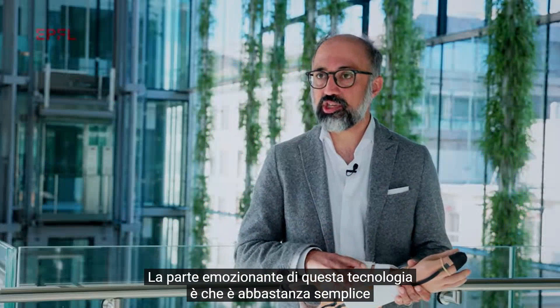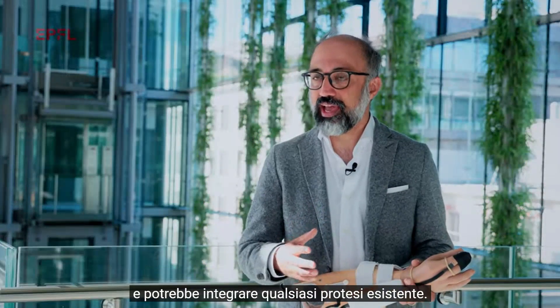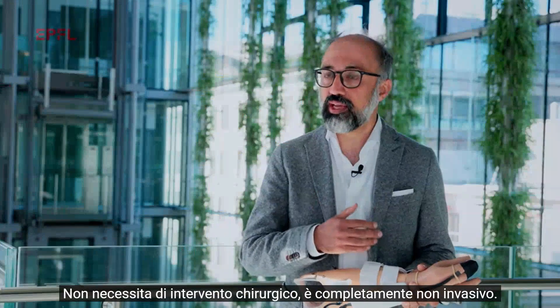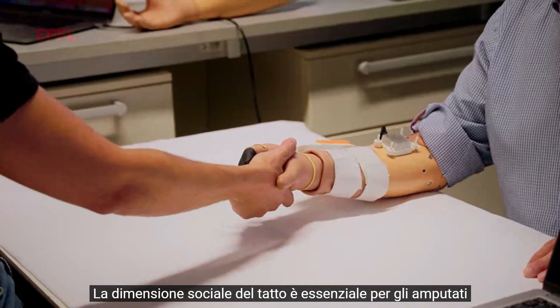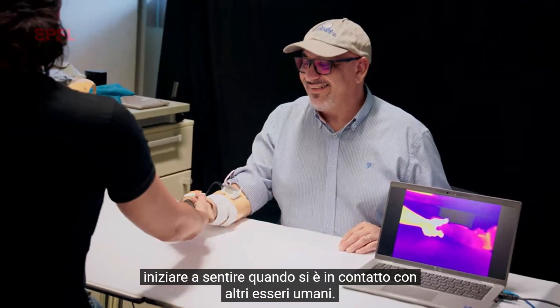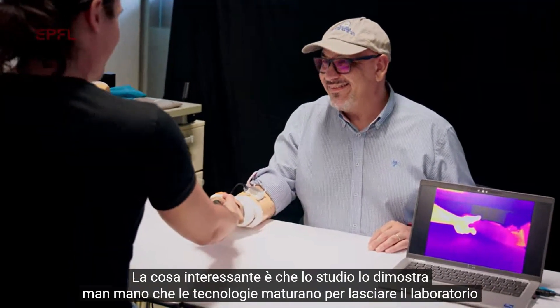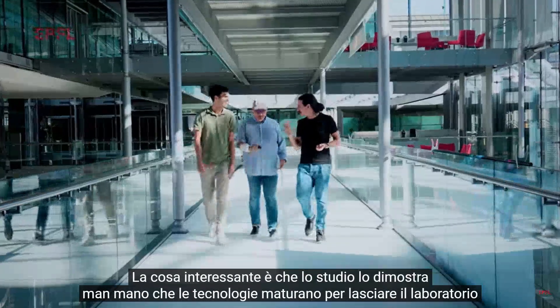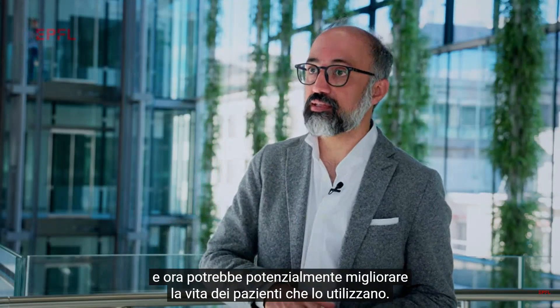The exciting part of this technology is that it's fairly simple and could integrate with any existing prosthetic hand. It doesn't need surgery — it's all non-invasive. The social part of touch is essential for amputees to start feeling when they are in contact with other humans. What is exciting is that the study shows that the technology is mature enough to leave the lab and could now potentially enhance the life of patients using it.